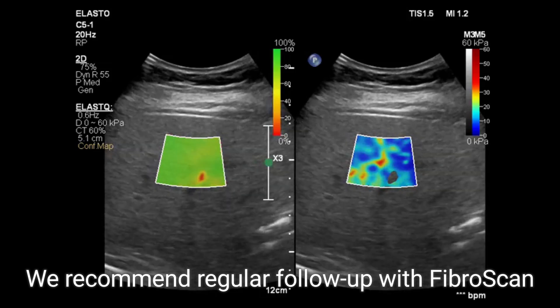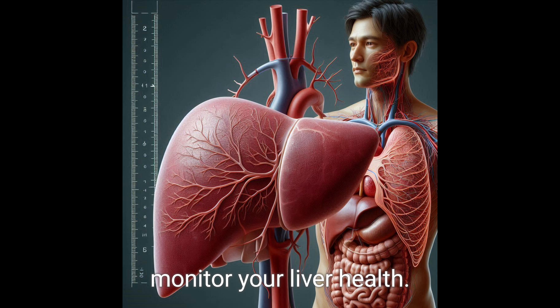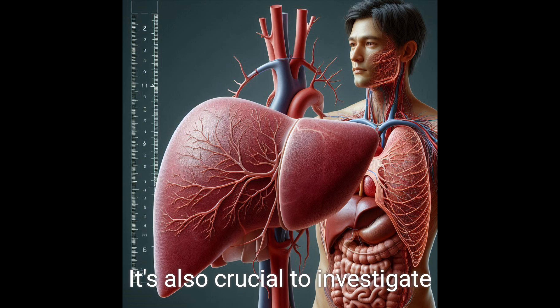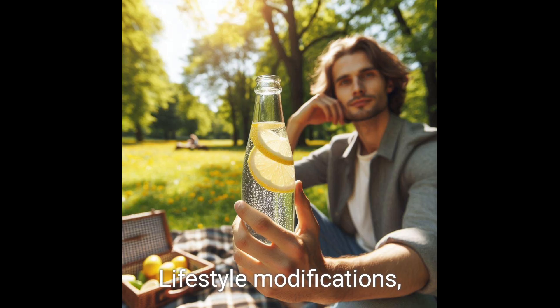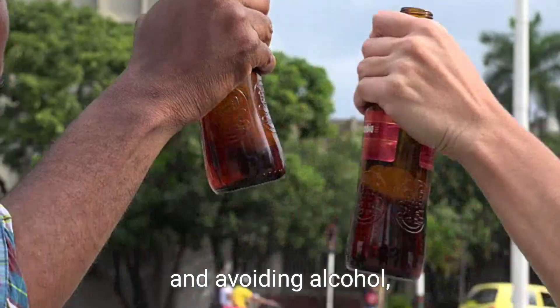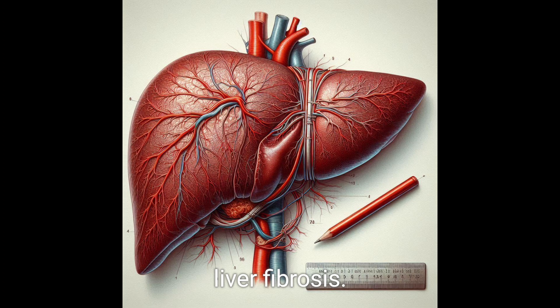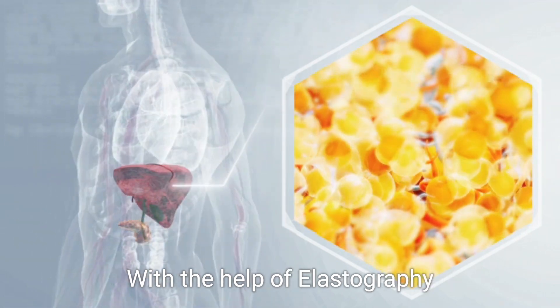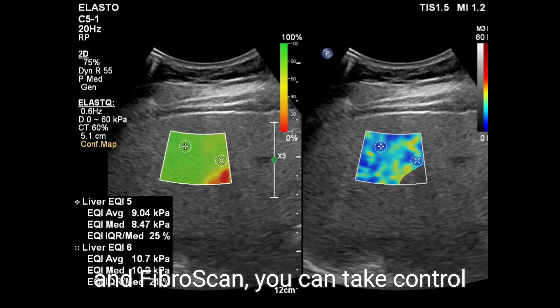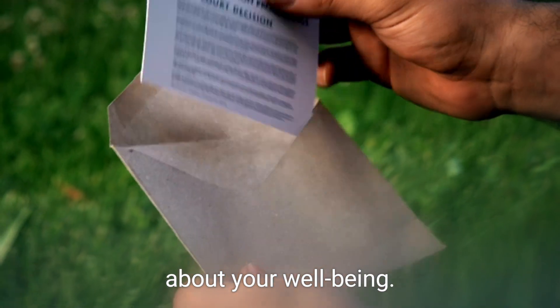We recommend regular follow-up with Fibroscan and ultrasound examinations to monitor your liver health. It's also crucial to investigate the underlying cause of fibrosis. Lifestyle modifications such as a healthy diet and avoiding alcohol can help manage and prevent the progression of liver fibrosis. With the help of elastography and Fibroscan, you can take control of your liver health and make informed decisions about your well-being.